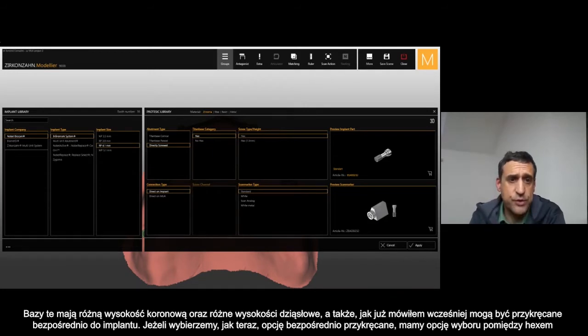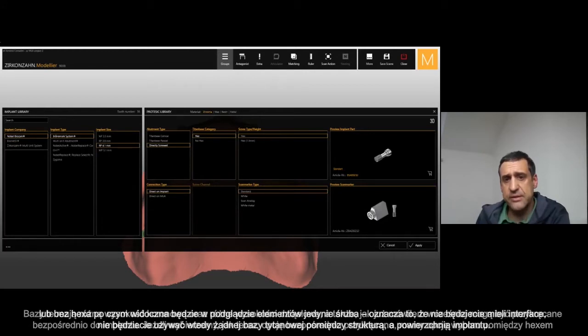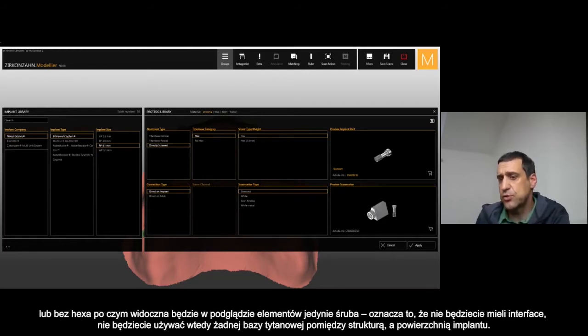If we choose direct screw, you have hex or no hex, and you get just the screw — meaning you have no interface, no T-base in between your framework and the implant connection.